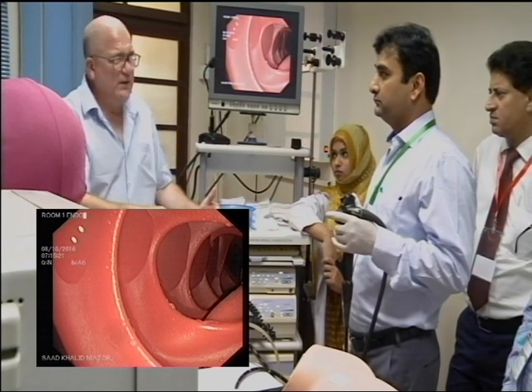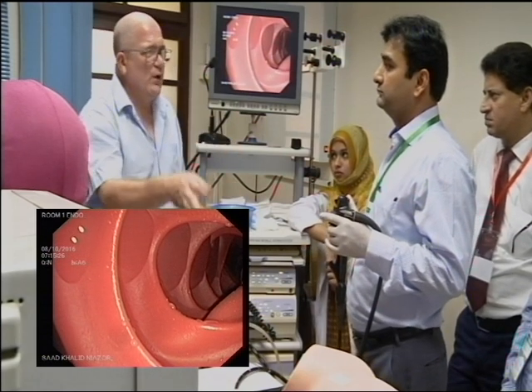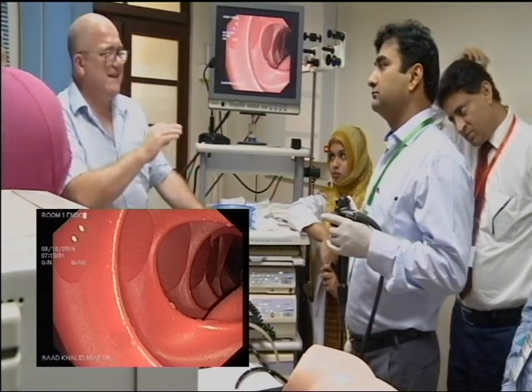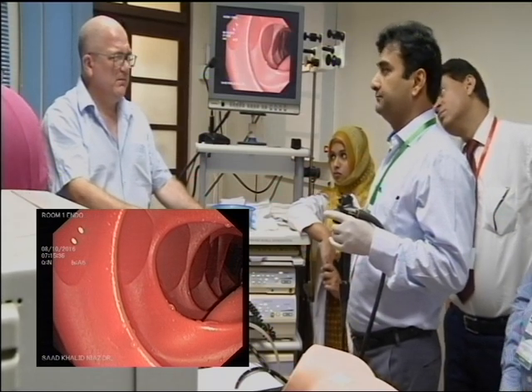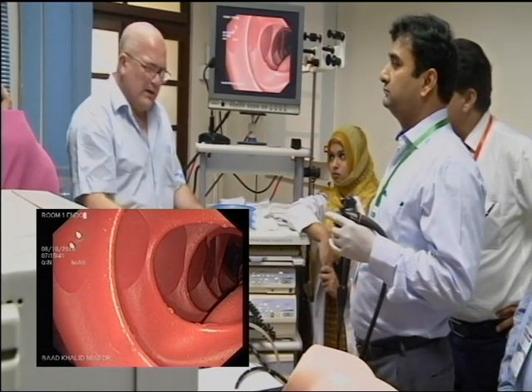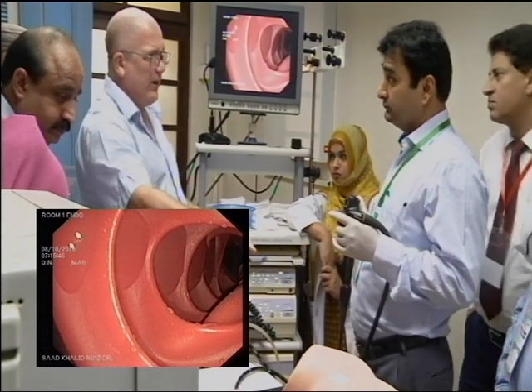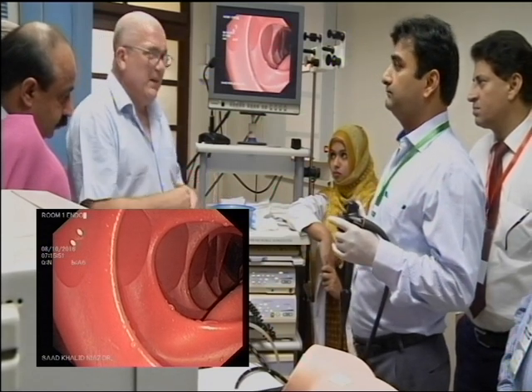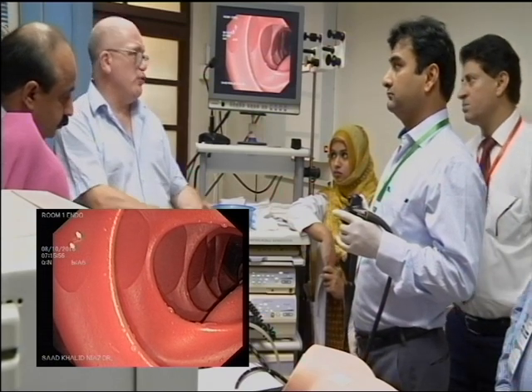But what we're trying to do is to get you to look at a safe way of doing it. And if you do something slowly and with purpose, you also will minimize your mistakes and the potential harm that you will do to a patient. I always tell people in the UK, this could be the one that puts you in court, this is the one that's going to cost you your GMC registration. So when you start to become a little bit, hey, I can do this, I make you feel very, very nervous. Because this could be the one that puts you in court.